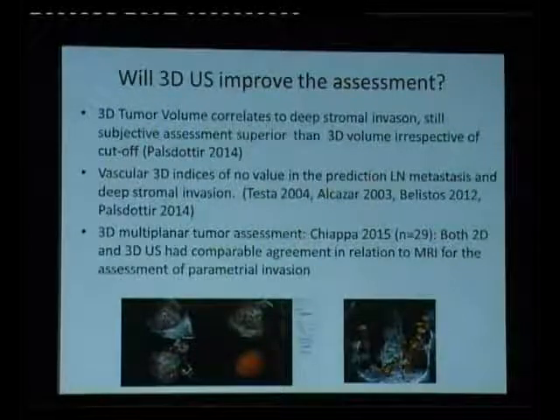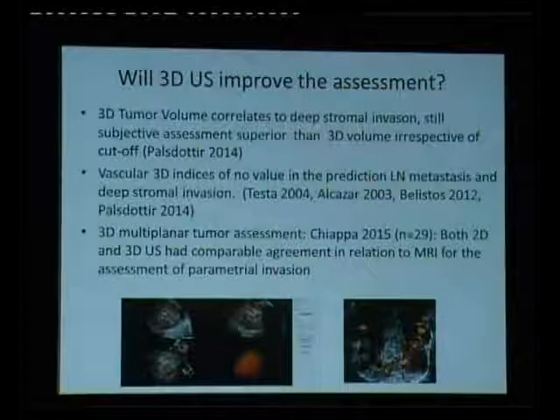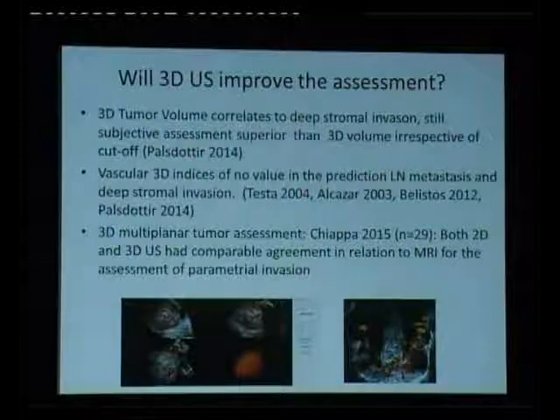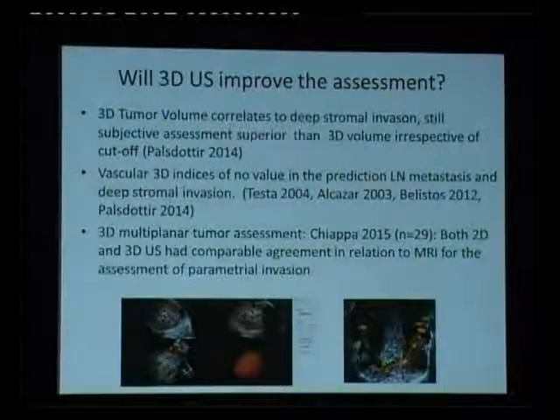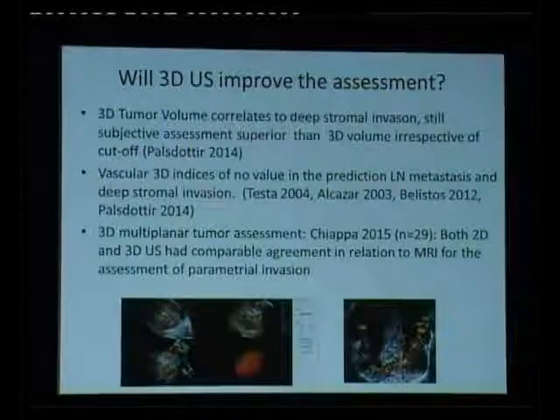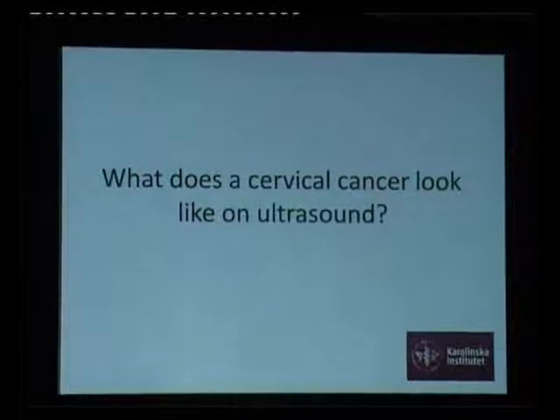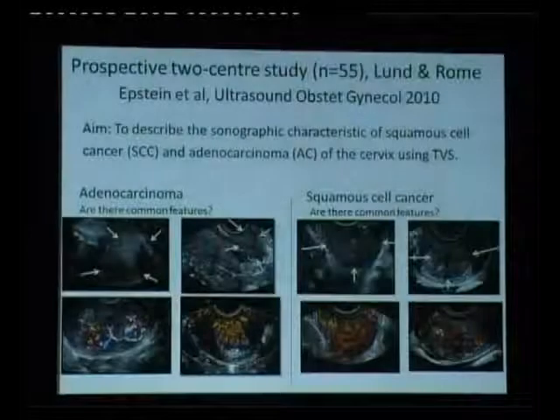In a recently published study by Chiappa and co-workers, they compared 2D and 3D multiplanar assessment of cervical cancer. They found that both 2D ultrasound and 3D ultrasound had comparable accuracy, and performed as well as MRI. So, what does a cervical cancer look like on ultrasound?